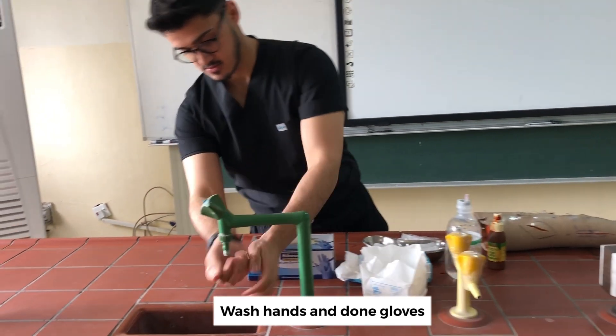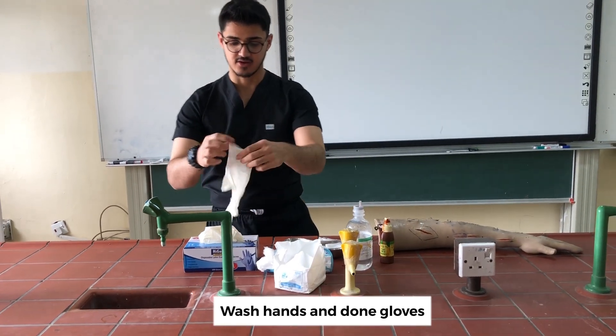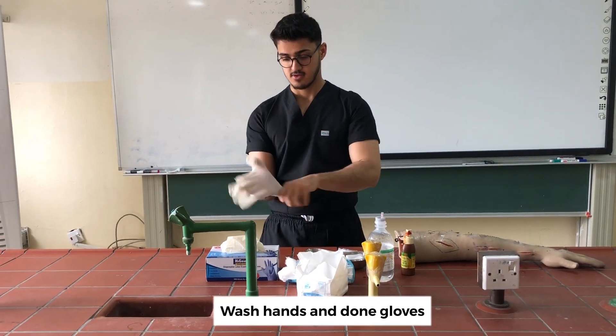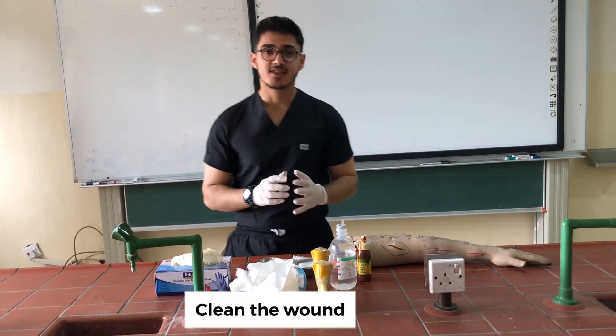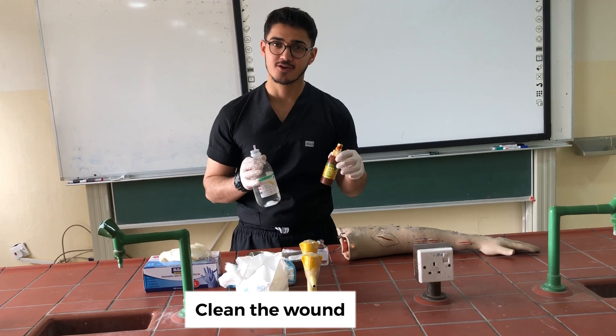Then I wash my hands, and we clean the wound either with normal saline or with iodine.